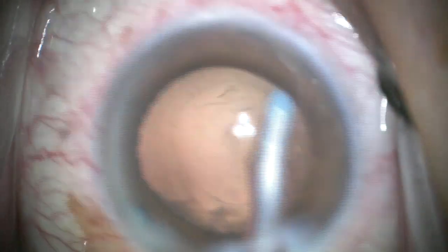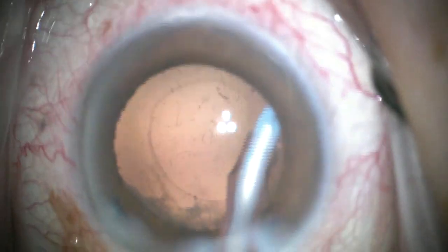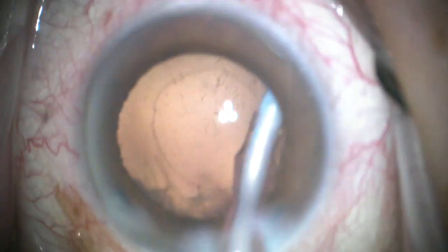So we remove the lens epithelial cells. Unfortunately not edited in here, I also turned down to a vacuum of five and very low flow rate as well, and vacuuming the posterior capsule routinely. Thank you for your attention.